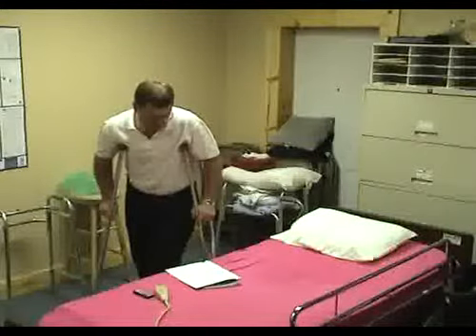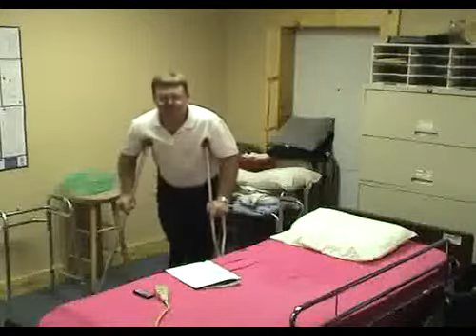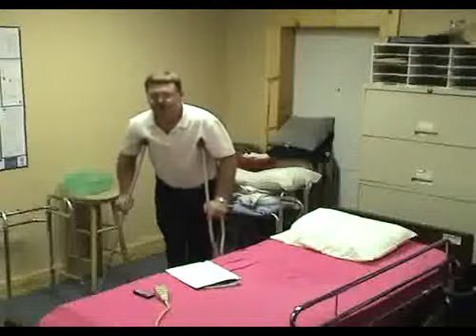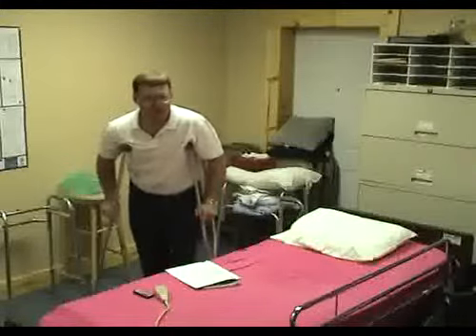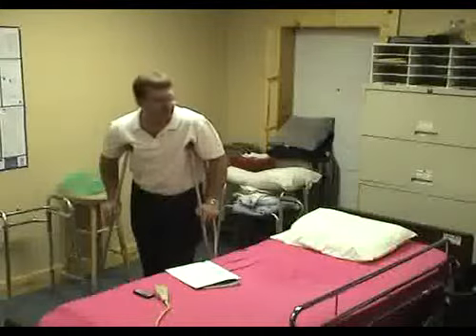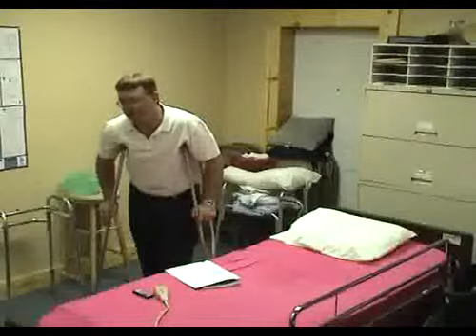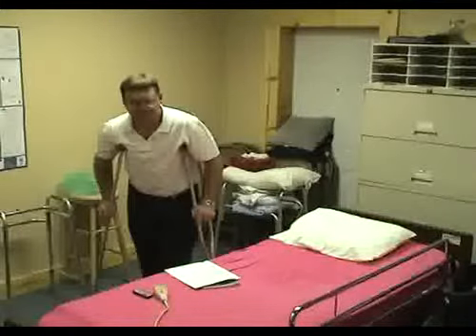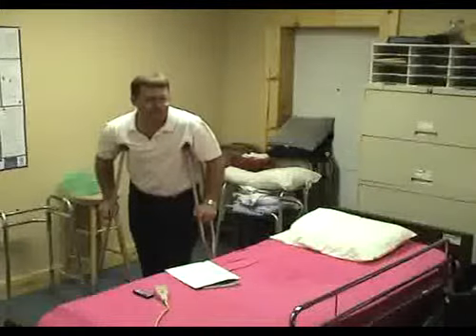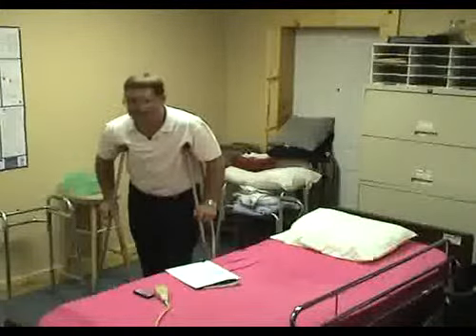Depending upon the device used, include the following. A, always place the device within easy reach, especially if you're going down to do laundry. The patient's sitting there in their chair and they use a walker or a cane. Make sure it is set right beside them before you leave, because if not, as soon as you go out the door, you're going to hear a thump, and there they're going to be laying on the floor because they got up to get their walker that you left across the other side of the room. They'll always do it.